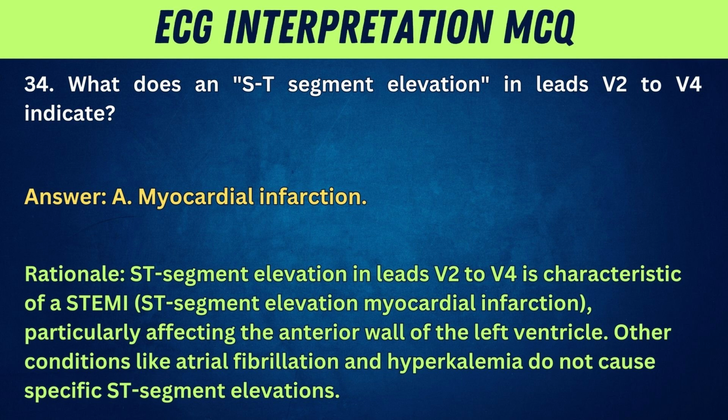ST segment elevation in leads V2 to V4 is characteristic of a STEMI, ST segment elevation myocardial infarction, particularly affecting the anterior wall of the left ventricle. Other conditions like atrial fibrillation and hyperkalemia do not cause specific ST segment elevations.